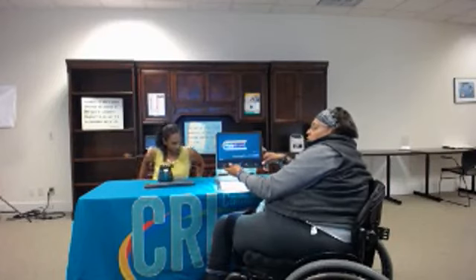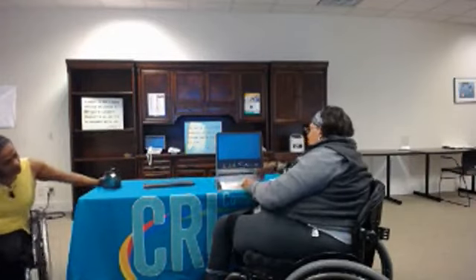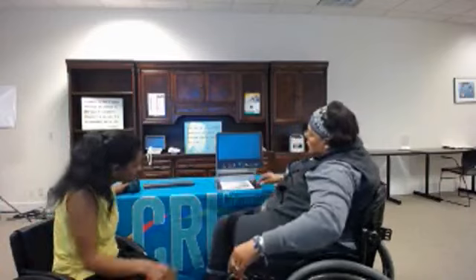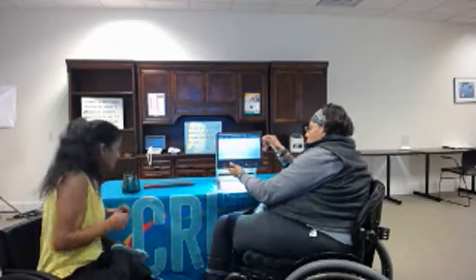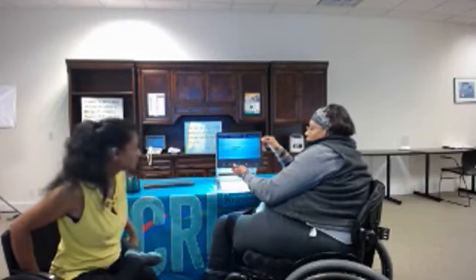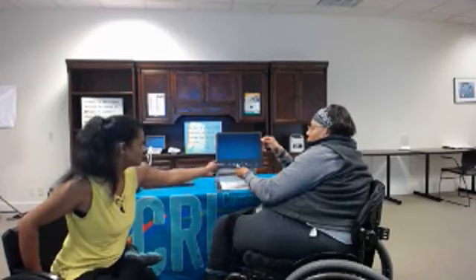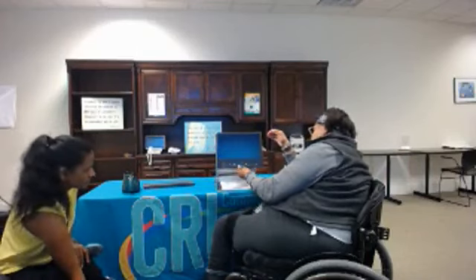Did it come with a charger? No. Show how you did that zoom again. The zoom? I think I did not. It enhances it to where you can see it. I do apologize. You can see it if it's in the box.